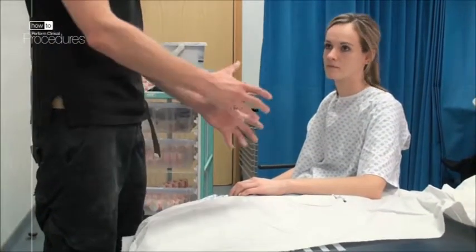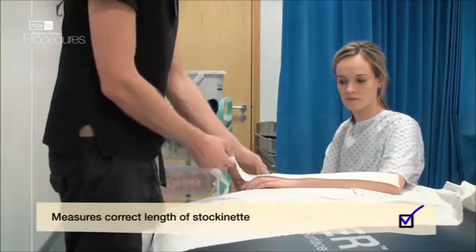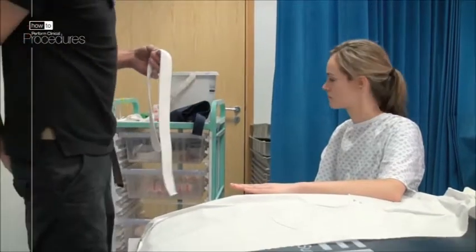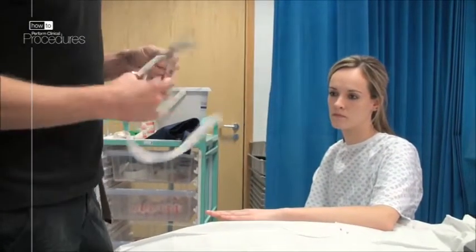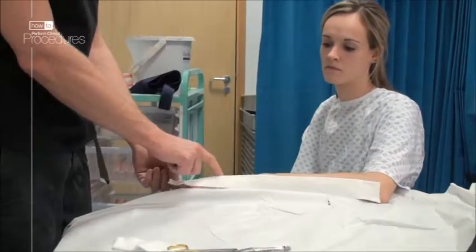Make sure your patient is sitting comfortably and that the arm is at a comfortable level for your back — this height-adjustable couch is ideal. First, measure the length of stockinette required: go from their elbow to the top of their fingers and cut the length accordingly. It should be longer than the plaster length so that it can be reflected back at either end to protect the skin.